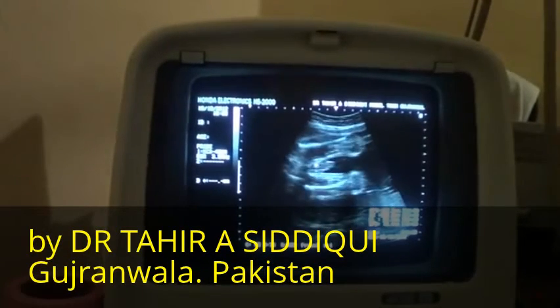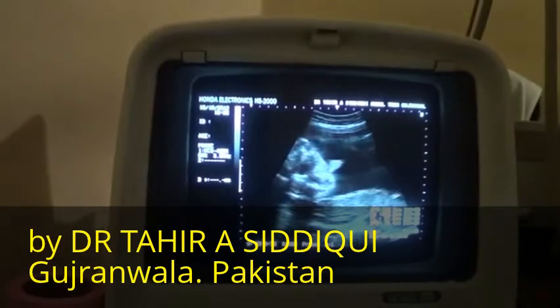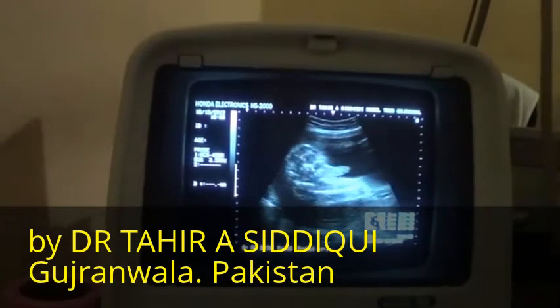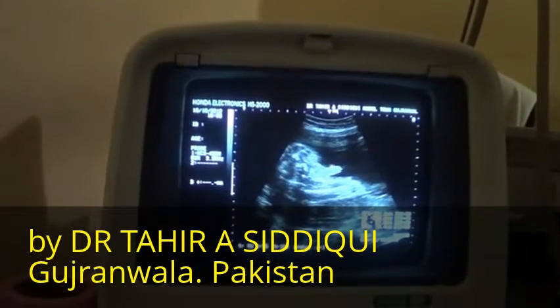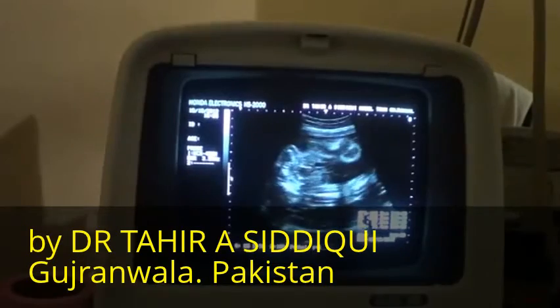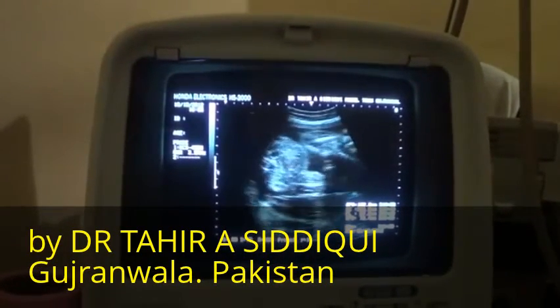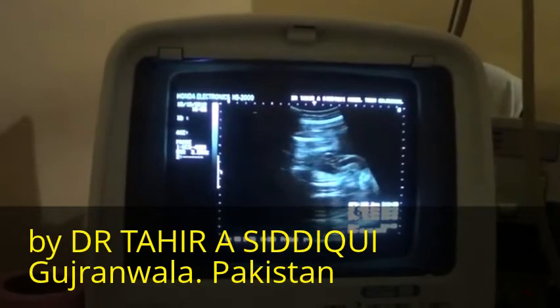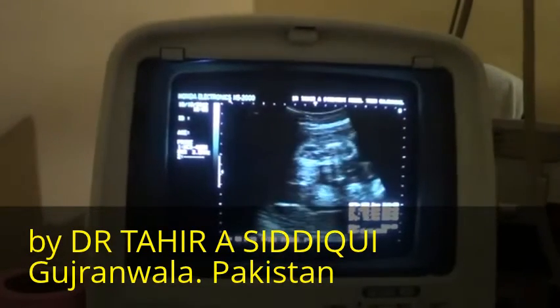This is the sex of the fetus. It is a penis. Now you see that this is the penis. So it's a male fetus. And this is the scrotum.